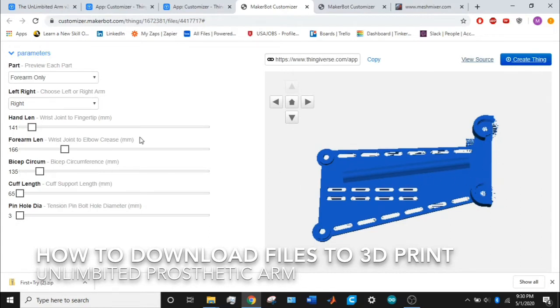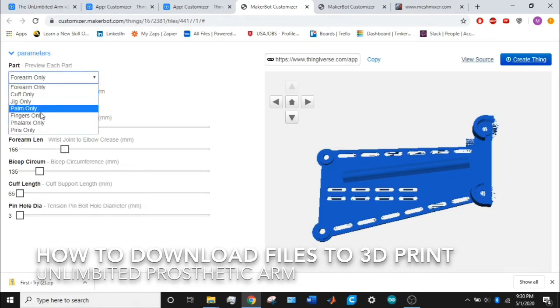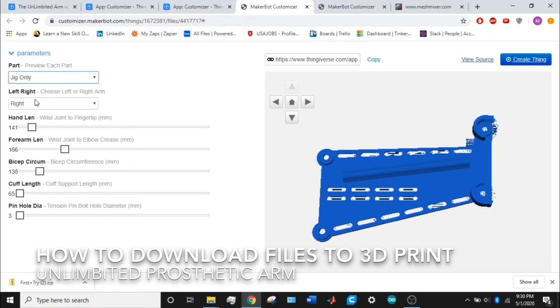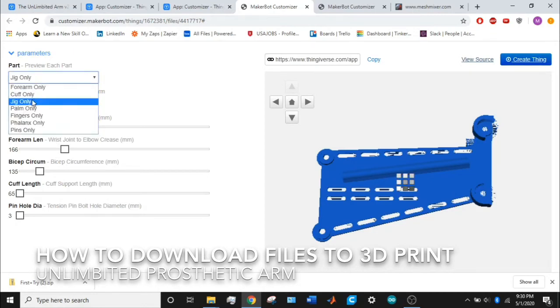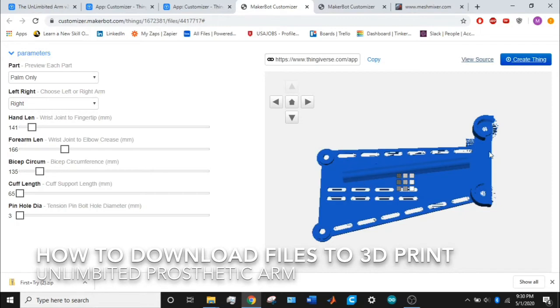Once you're done with that, you don't need to mess with any of the other lengths—just forearm length and bicep. The cuff and pinhole diameters, leave them alone. The hand length is just the length from the palm only, from the bottom of the palm to the edge of the fingertips. That part comes up—I'll show you there.